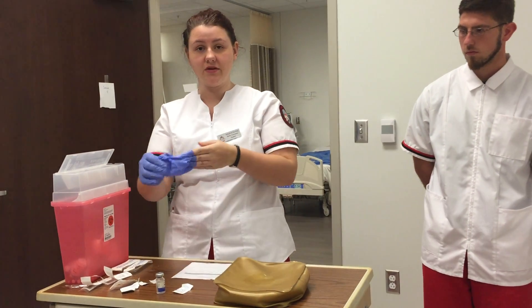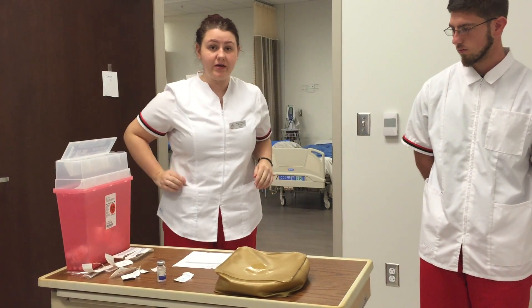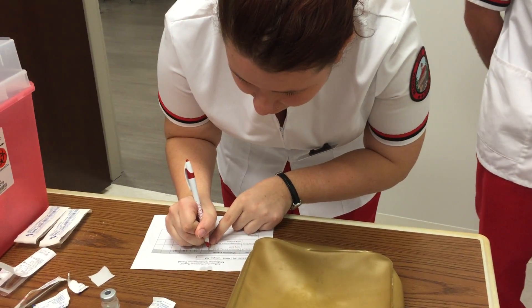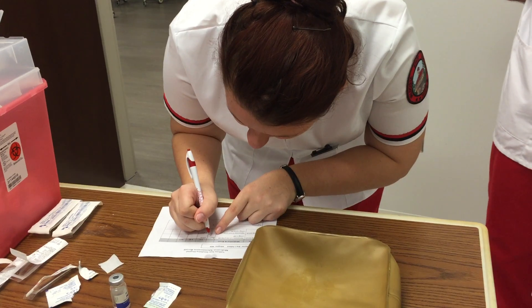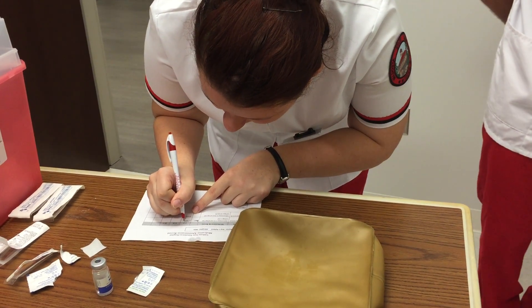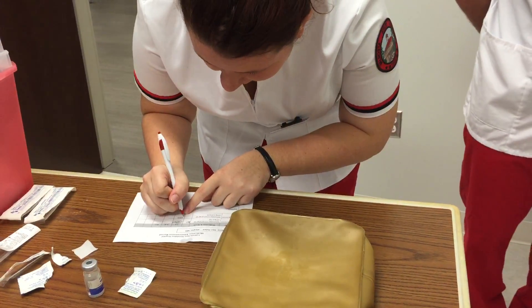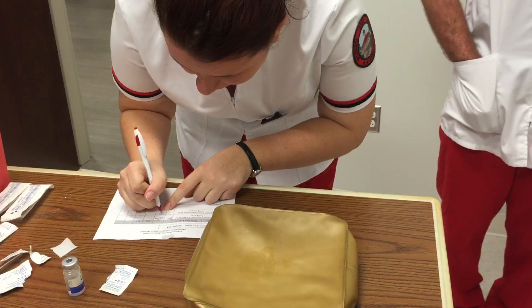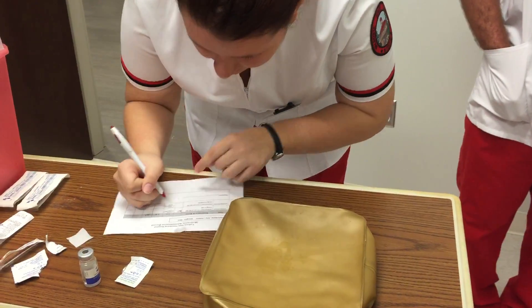I don't have any more sharps out. I'm going to take off my gloves and do hand hygiene. Now I'm going to complete my MAR — documenting that I gave the IM injection in the left ventrogluteal with my initials, and for the subcutaneous injection I'm documenting the left posterior arm with my initials. I'll sign my signature to complete the MAR.